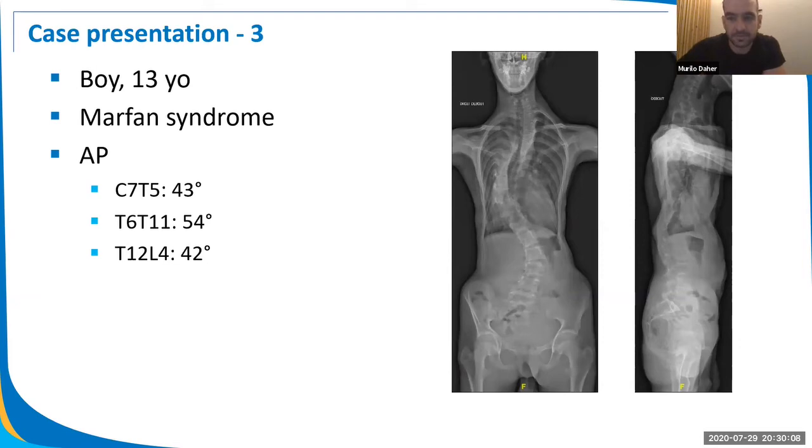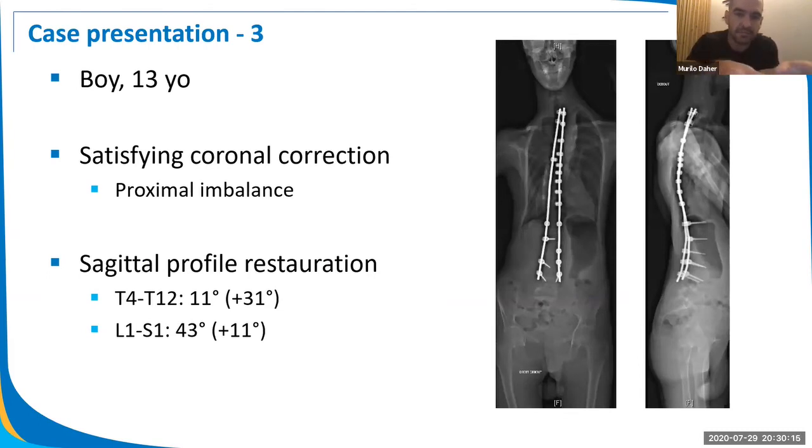But my question is about the proximal fixation. In the two cases that you showed, I think you had problems because of this claw without any screw adjacent to it, or without any band adjacent to it. What do you think about proximal fixation strategy nowadays? Do you continue using the claw, or you may use this particular claw that Implanet has, the Jazz claw, that's very stiff too, or you should put some screws in conjunction with this? In the regular cases, what's your proximal fixation strategy?